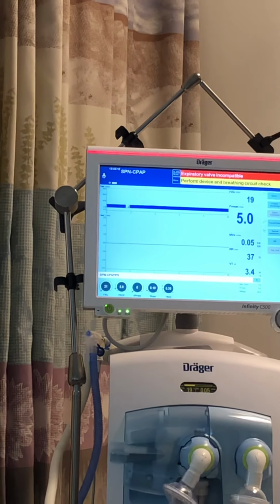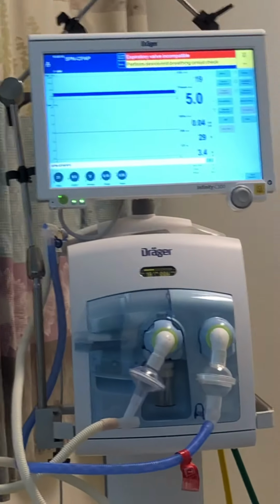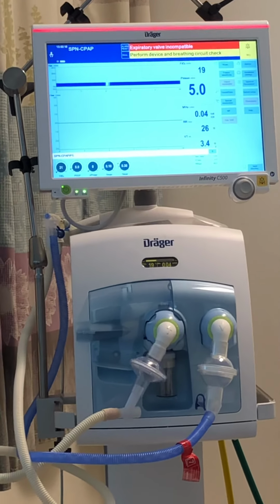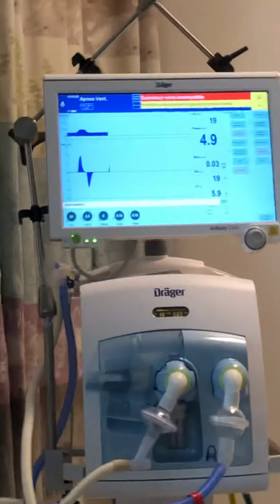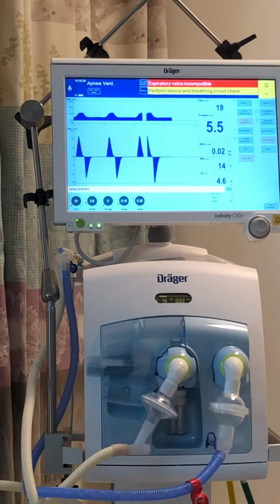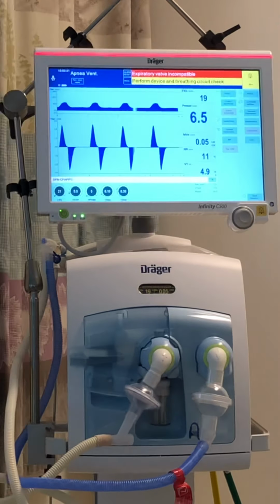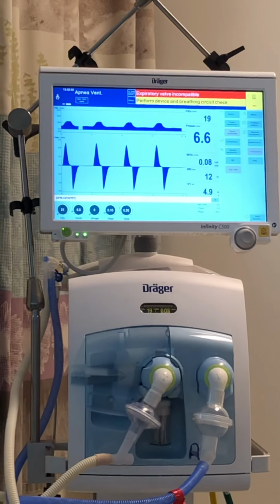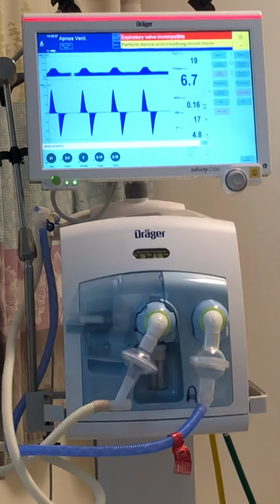What are we looking for? CPAP? Oh, I see it. Where is it? Oh, so it's the P bar mean? She closed it. Oh, she did? Yeah. Okay, good. Not gonna blow anything up, but probably.